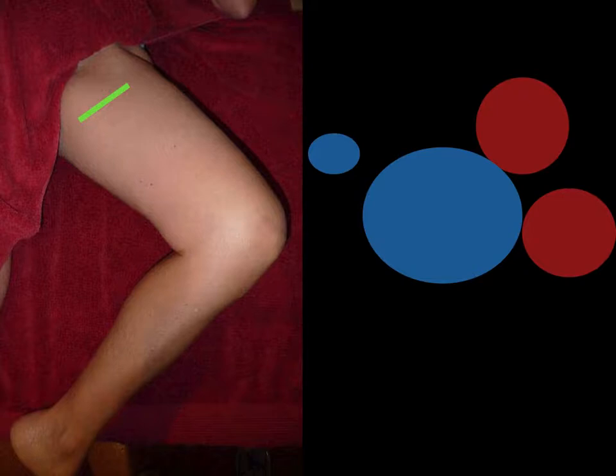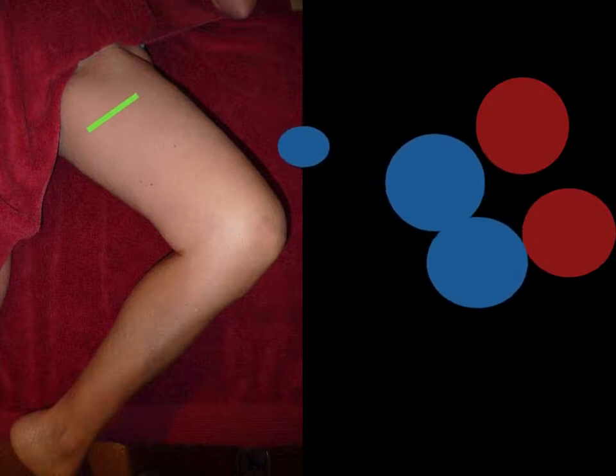We're going to come down even further, more distally, and we are going to see where that common femoral vein now is the superficial femoral vein and the deep femoral vein. You may still be able to see a little bit of the greater saphenous vein medially. If you lose it by this point, it's not a big deal at all.